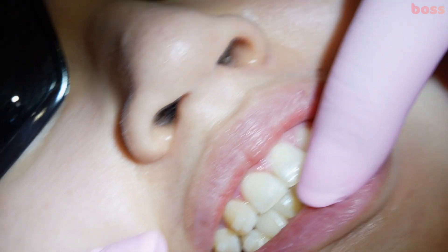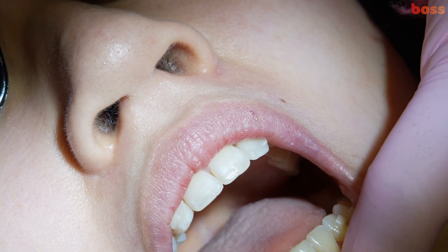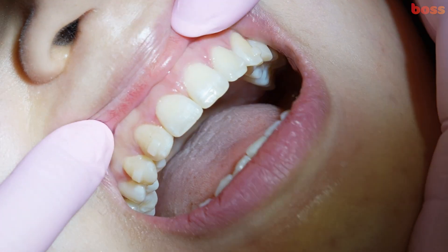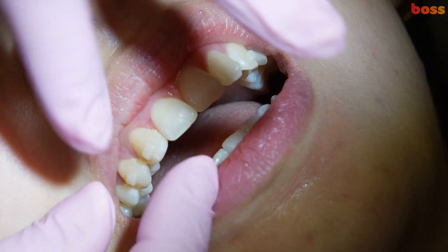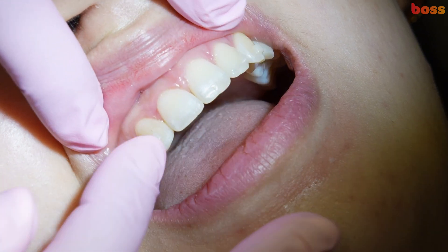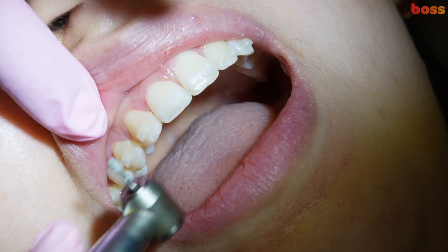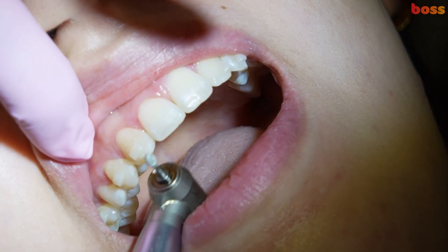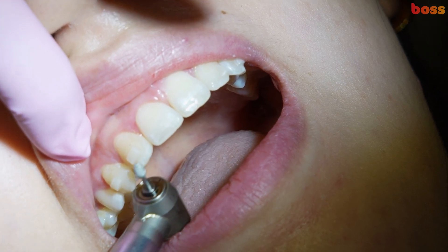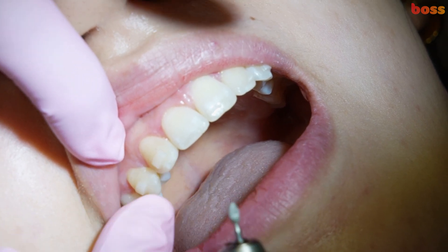There's still a little bit of derotation required in the lower incisor region. Today we're getting to those final stages — we're going to reshape the canine to mimic the lateral. The first thing I'll be doing is changing the occlusal anatomy from a cuspal tip to a flatter profile. I use a coarse diamond for that; you can also use a soft flex disc or tungsten carbide.